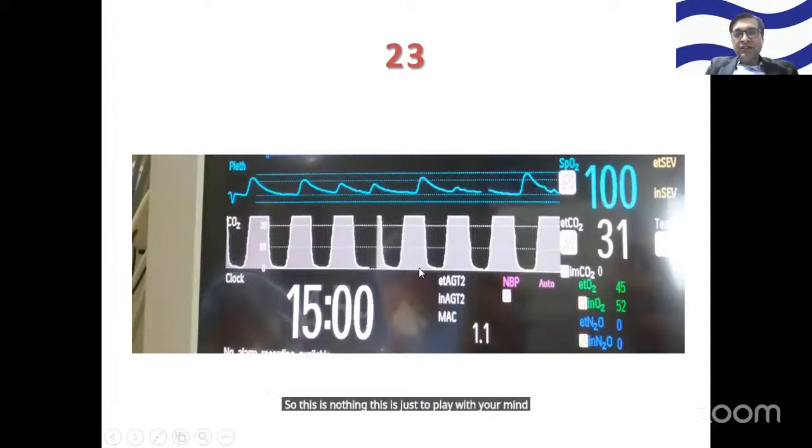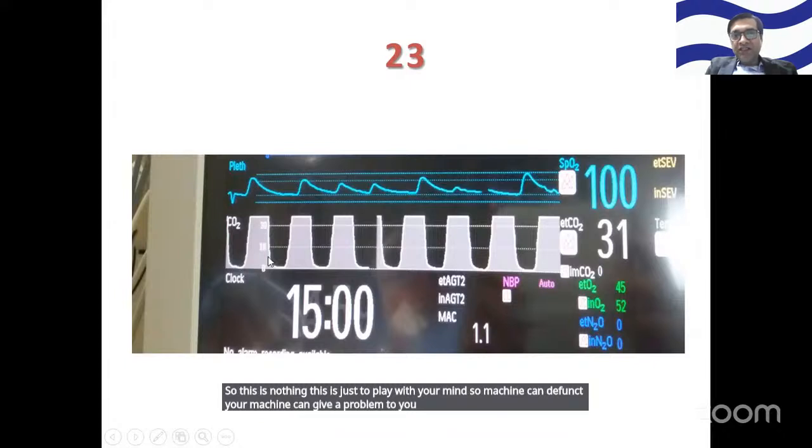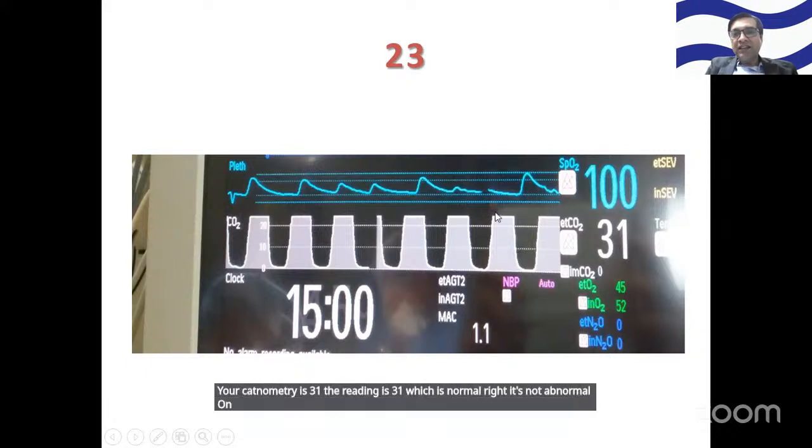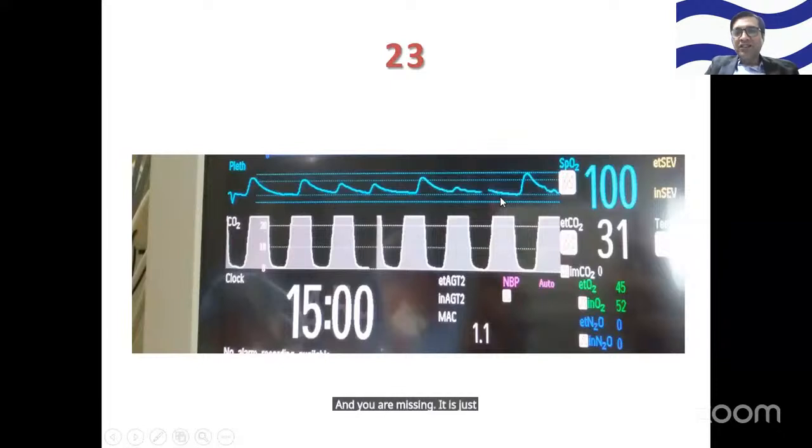So the machine can malfunction, the machine can give a problem to you. I have changed the scale from 0 to 40 to 0 to 20. Your capnometry reading is 31, which is normal, right? It is not abnormal. Only you can see the spike in the waveform because I've changed the scale setting. But capnometry is normal. It is just a machine issue, probably.